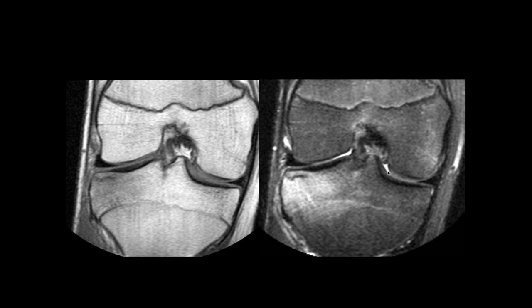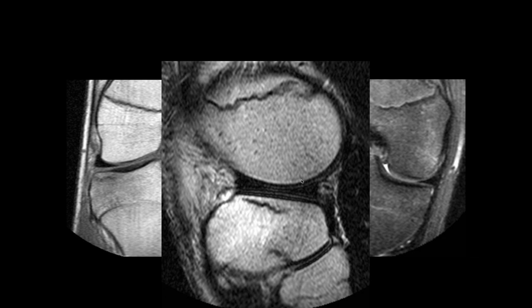So we see that kind of incomplete hypointense linearity in the medial tibial plateau with a surrounding edema. So it just looks like kind of a subchondral fracture. And this patient looks younger, so it's not going to be an insufficiency fracture. It's kind of an incomplete subchondral fracture here. It's low in signal because the trabecular bone are compressed.